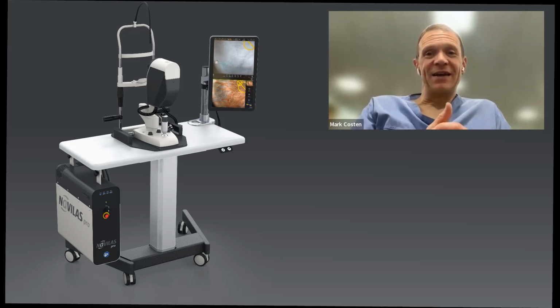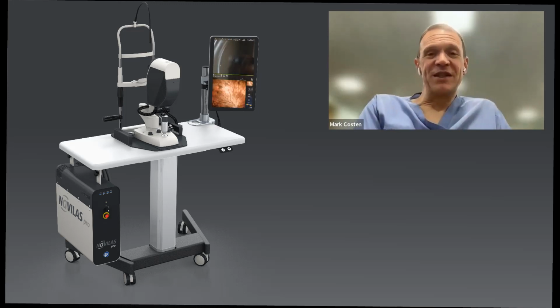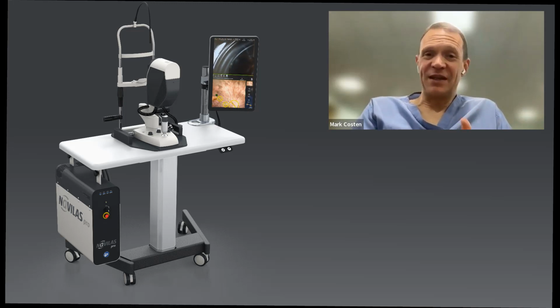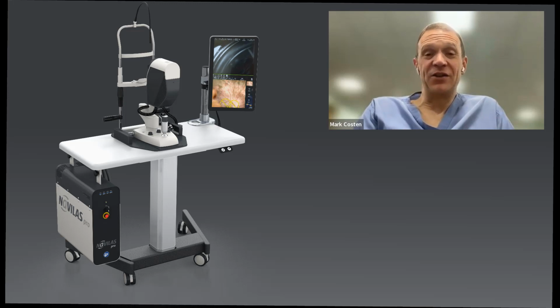But because of that, I know we've spoken before, Julian, when you were demonstrating it, you've got to imagine yourself more as an imaging technician, because you're taking photographs and you're treating based on that. Once you get your head around that, and we're all used to using iPads and digital technology, people pick that up incredibly quickly, and it's a refreshing change. So yes, there is a learning curve, and you have to have some training, but my experience of cascade training this to other clinicians is very, very positive.